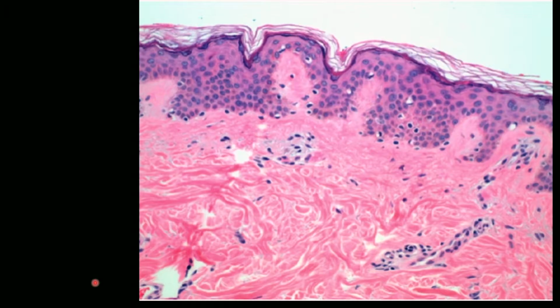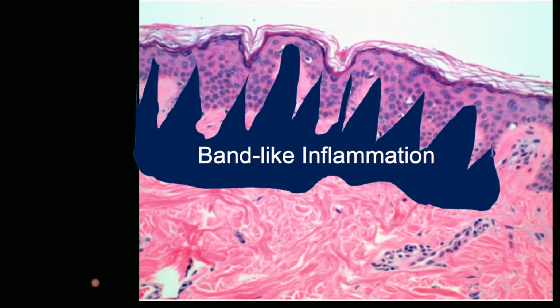So as always, I like to start with the normal skin and then show you what happened in cartoon, and try to understand the histology before we look into real images. So in lichen planus, we see band-like inflammation that basically obscures the dermal epidermal junction and spreads apart from the epidermis, making the epidermis thin at the end, so the tips look like a sawtooth pattern, as we see here. And also we see the Civatte bodies, or dyskeratotic keratinocytes, at the base.